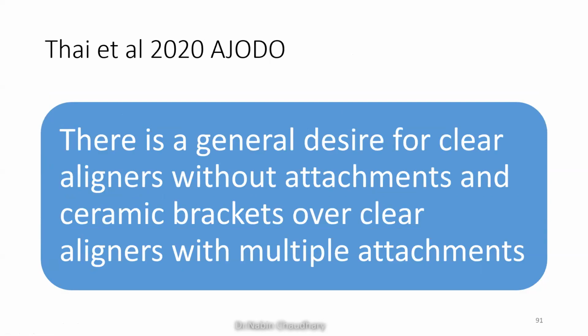So attachments are generally required in the case of the Invisalign system. One of the authors, Thai et al. in 2020, performed research and found that there is a general desire for clear aligners without attachments, and if multiple attachments are required in the clear aligners, then patients generally prefer clear brackets over clear aligners.